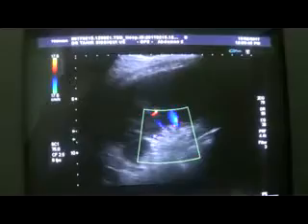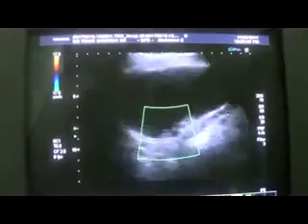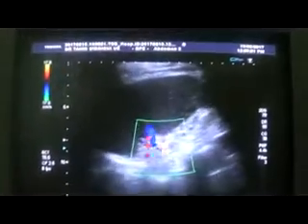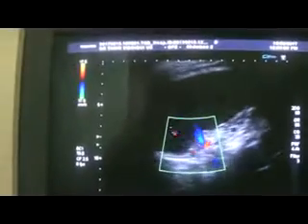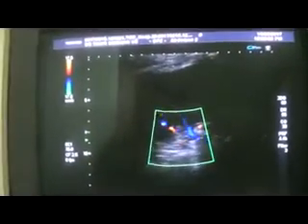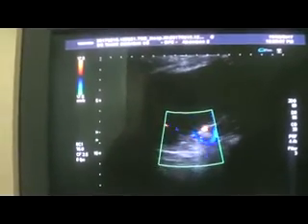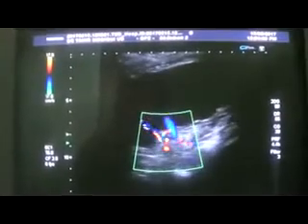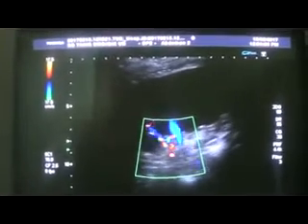Here you can see the vessels at the hilar region. The splenic vein is visible even now despite embolization. The splenic artery can also be seen, and this is the hilum of the spleen.